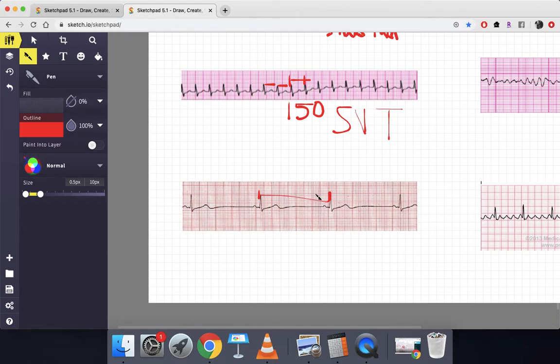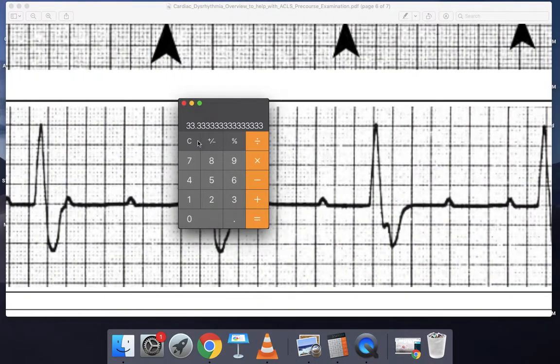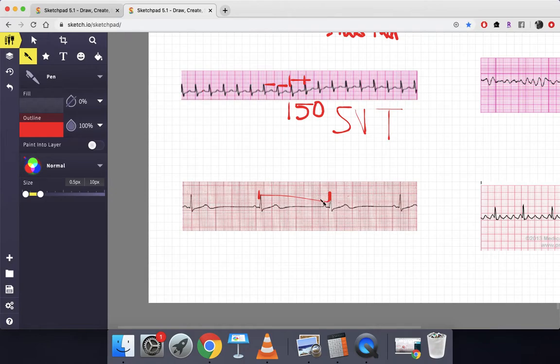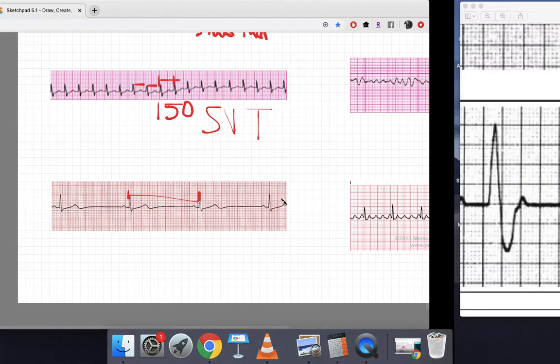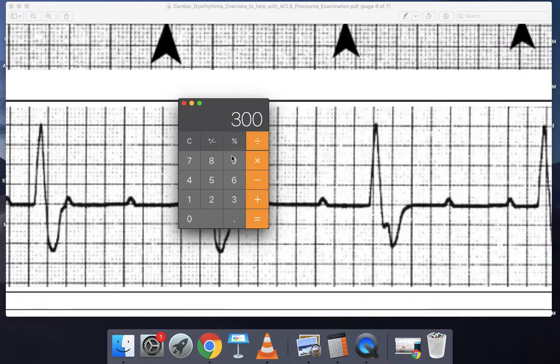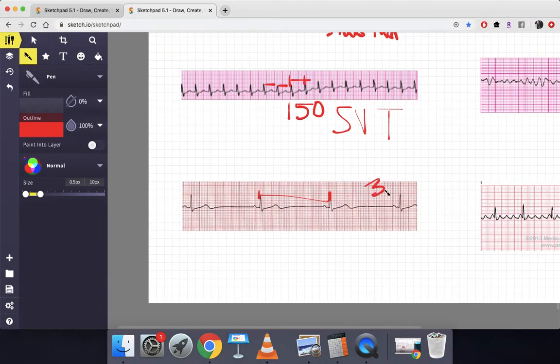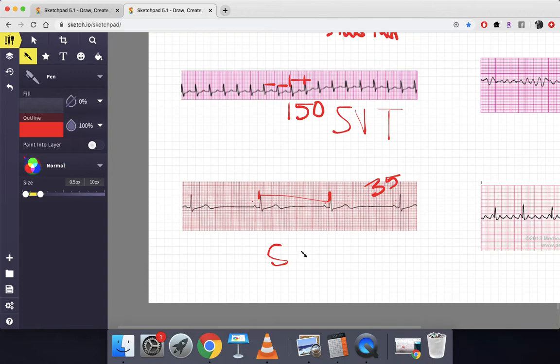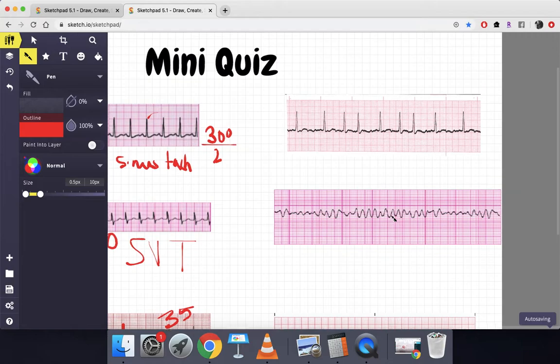Next one: the R interval is really long — one, two, three, four, five, six, seven, eight and a half boxes. So 300 divided by 8.5 is approximately 35 beats per minute. Are there P waves? There's one P wave, another P wave, another P wave. This is definitely bradycardic with P waves, so this is sinus bradycardia.